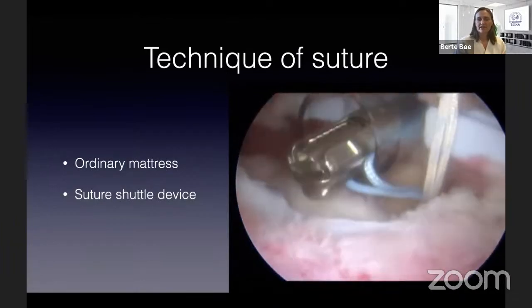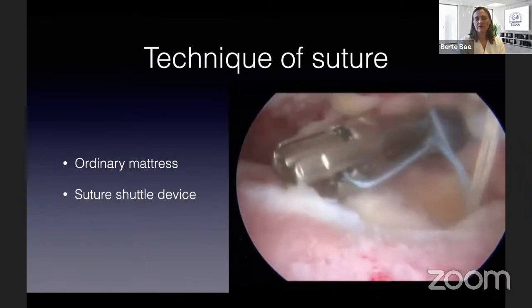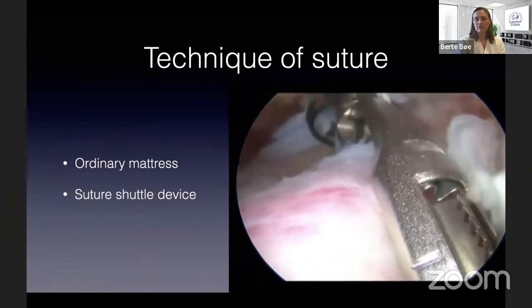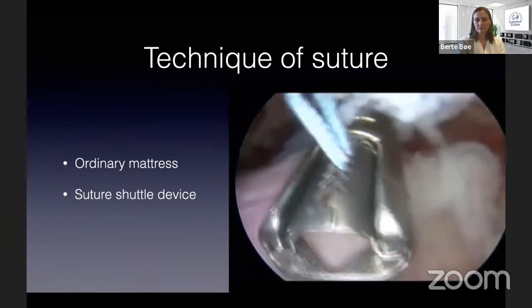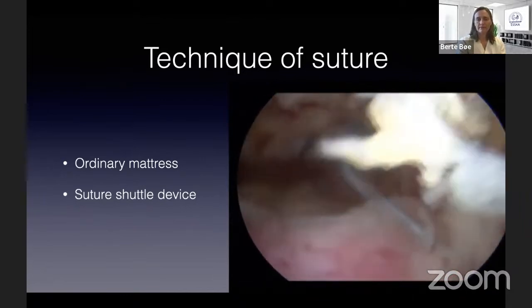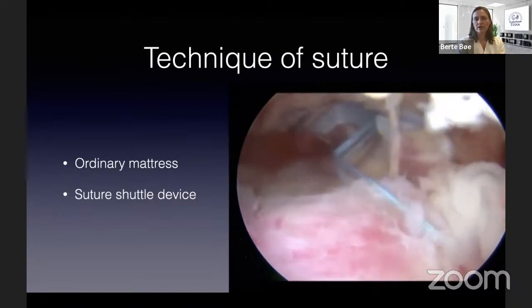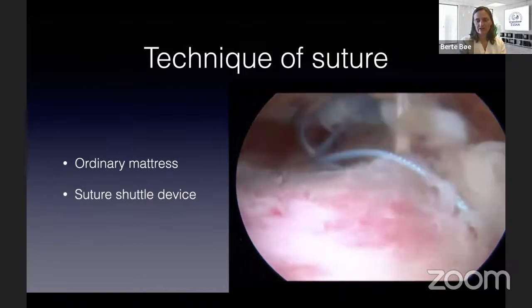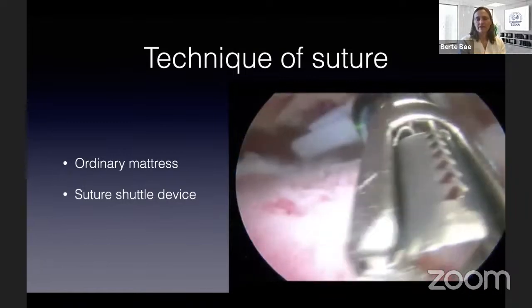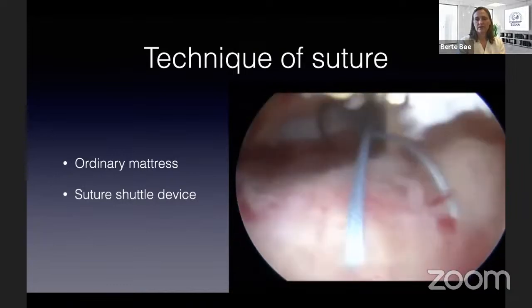And there are different techniques, of course. There's not just single or double row, but there are different ways to do also a single row. This is an ordinary mattress suture with this suturing device. Many studies that have compared single and double rows are comparing very old-fashioned single row with an advanced double row.